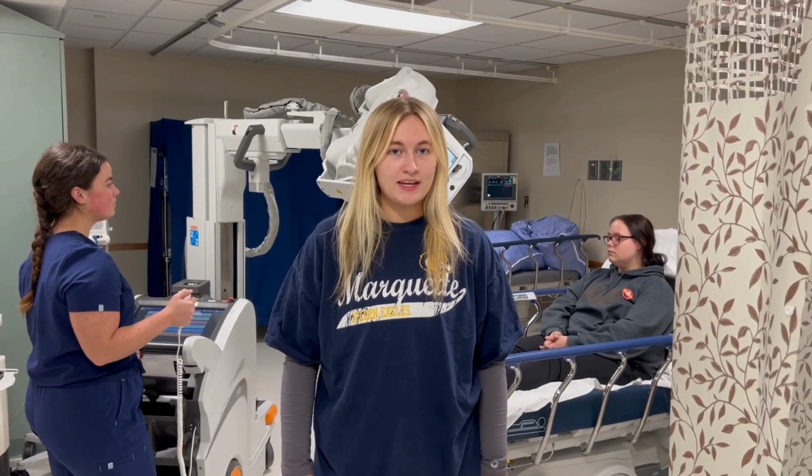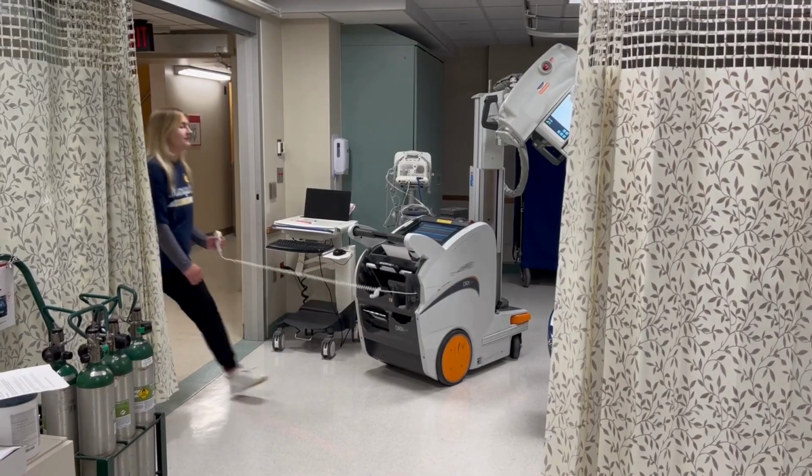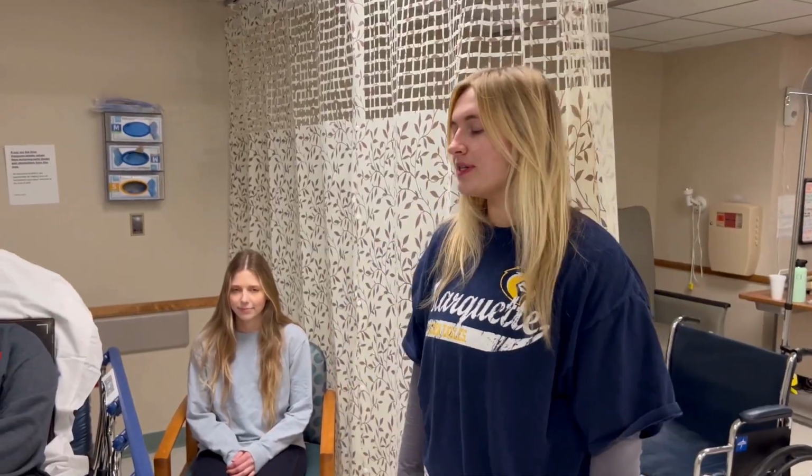The amount of radiation exposure is inversely proportional to the square of the distance. This means double the distance from the X-ray source can reduce radiation exposure not by half, but by a fourth. And remember to always ask other family members to step out of the room before you expose the patient. Also, take 2 steps back behind the portable X-ray machine, and this can reduce exposure by 80%.